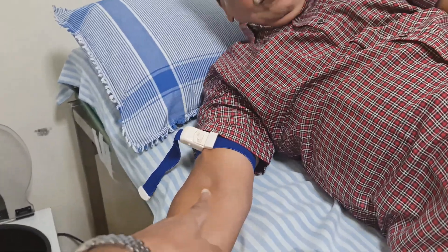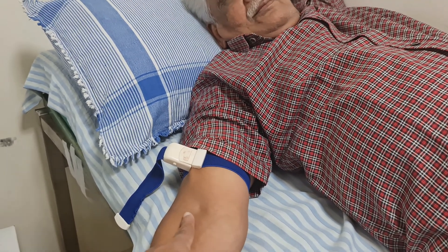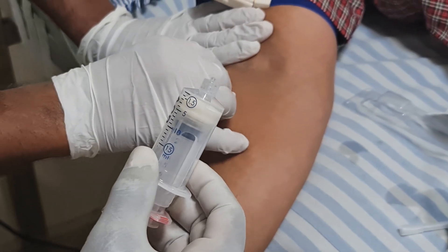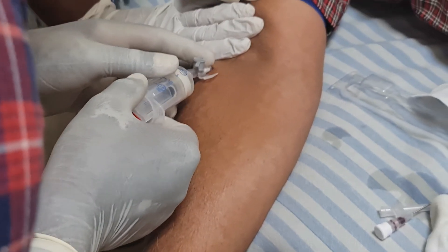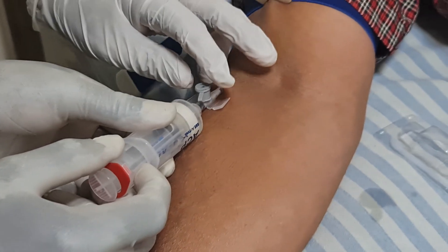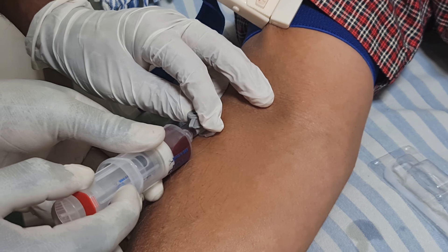We are going to draw blood from this cubital vein. The cubital vein is the vein in the front of the arm. You can see a good vein there. Now we are connecting the ACP syringe. Blood is flowing smoothly into the double-barrel syringe. This is a double-barrel syringe, proprietary to this particular company.